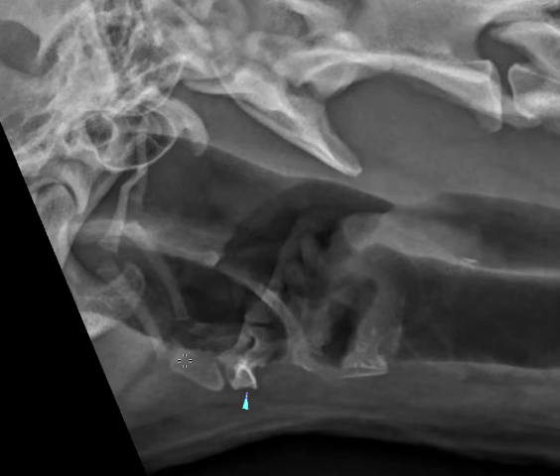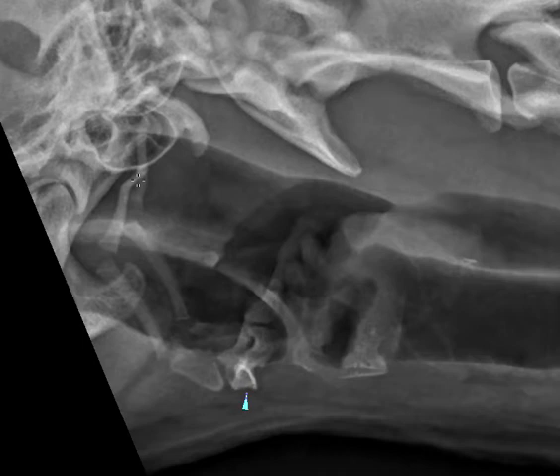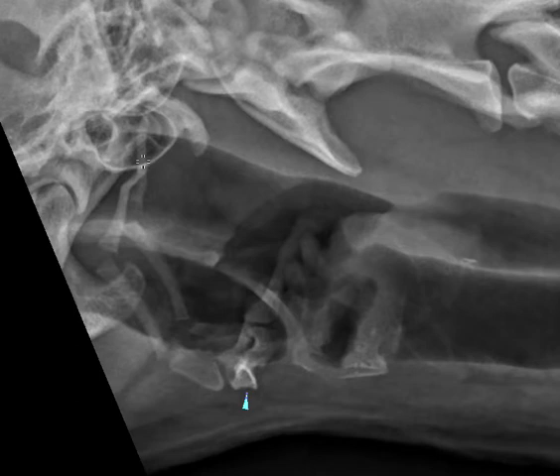Extending cranially from the basahyoid bone is the majority of the hyoid apparatus, and they have this little articulation that makes them look like a cute little animated alien. The first one is ceratohyoid - it's fairly short. Then we have a joint, which is a radiolucent space, and the same thing on the other side. The next one, after the ceratohyoid, is epihyoid. Then we have stylohyoid, which takes us up to the base of the skull. There's also anatomically what's called a tympanohyoid, which is a little extension from the stylohyoid that helps it join to the base of the skull.